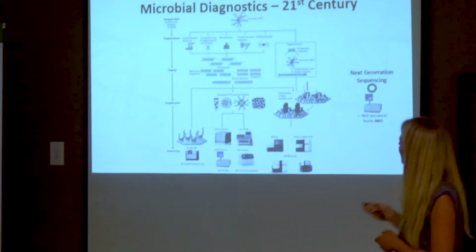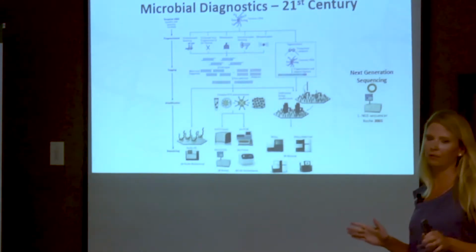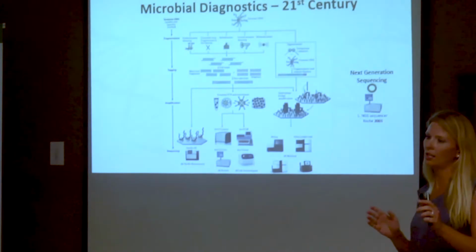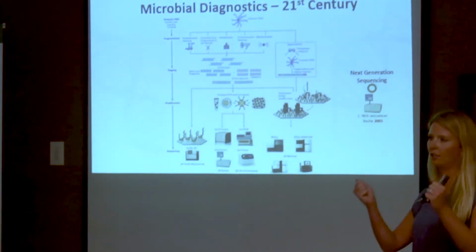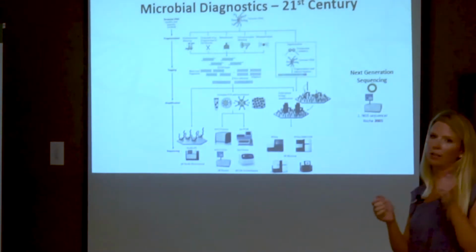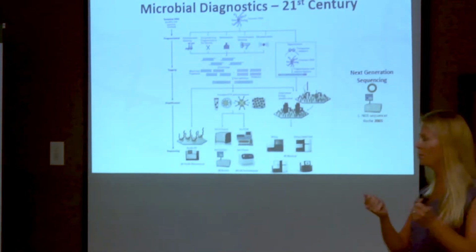And what it basically means, you have your genomic DNA. It can be any kind of sample. If it's a pure culture or a fecal sample or a urine sample, it doesn't matter. You have all those different organisms in there, and you break all their cells open. You can do that by sonication or by beating them or chemically. As long as there's DNA, you can break it open.